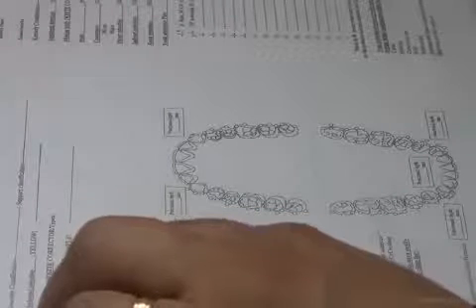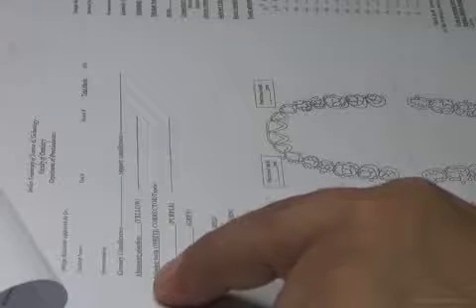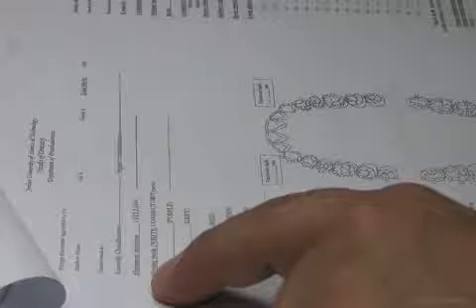Missing teeth, we're going to wipe them away with a corrector. Teeth intended for extraction, we leave them. We don't draw on them, but we leave them on the page to note for the technician that there is a tooth here, so you are not confused, even if it's planned for extraction.